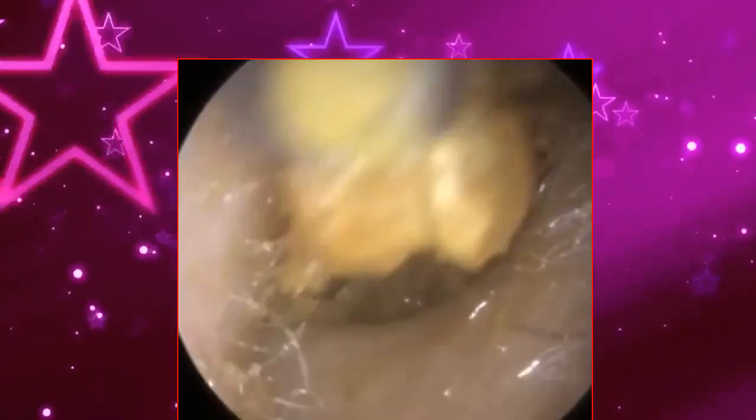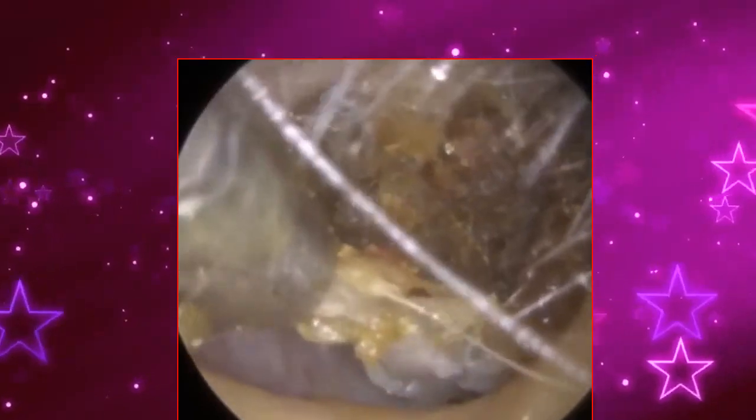This patient wasn't actually experiencing any otalgia. So I think we just caught the keratosis obturans before it was going to become problematic. I'll call it a grade 0 if I'm honest. But you get different grades. There is no grade 0. I'm trying to create that one myself. Grade 1 is the mildest form of keratosis obturans. You could classify this as grade 1, I suspect, but the patient didn't have any pain. Characteristic of keratosis obturans is a bit of pain and widening of the ear canal. I wouldn't even say the patient's got a significant widening, hence why I was calling it a grade 0, but if it had been left any longer, it would have been a grade 1.